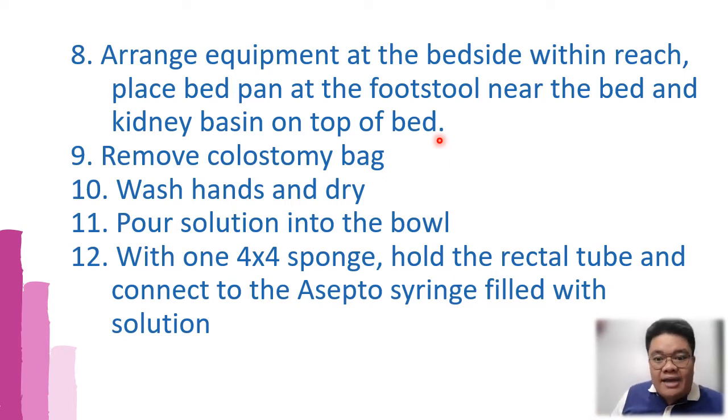Class, it's a bedpan. It's the one receiving your fecal matter. So class, that should be below the patient so that it will not be easily accessible, for the purpose of infection. We don't want it to be spreading infection, but we want it to be within reach.